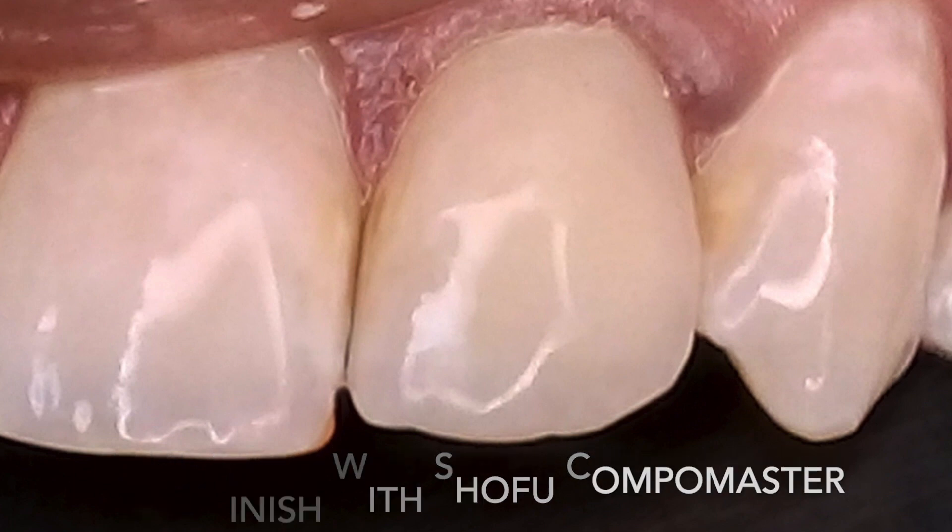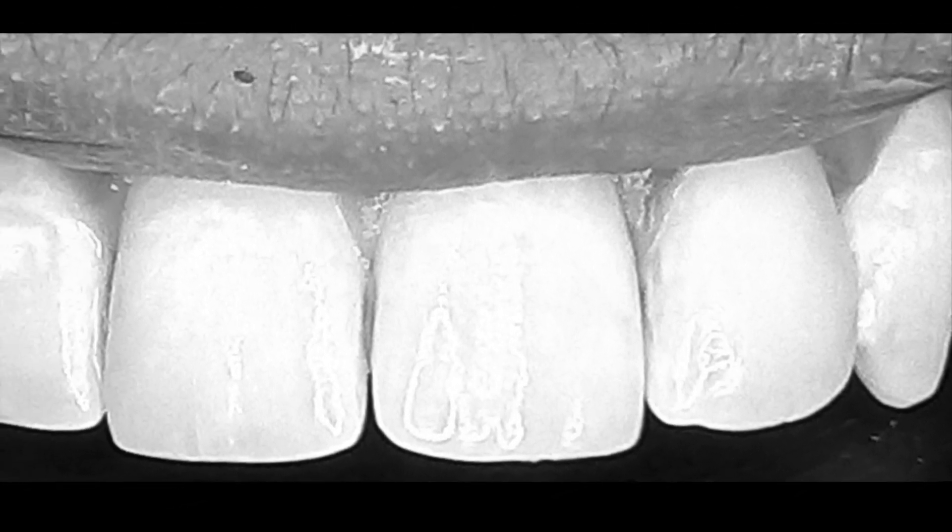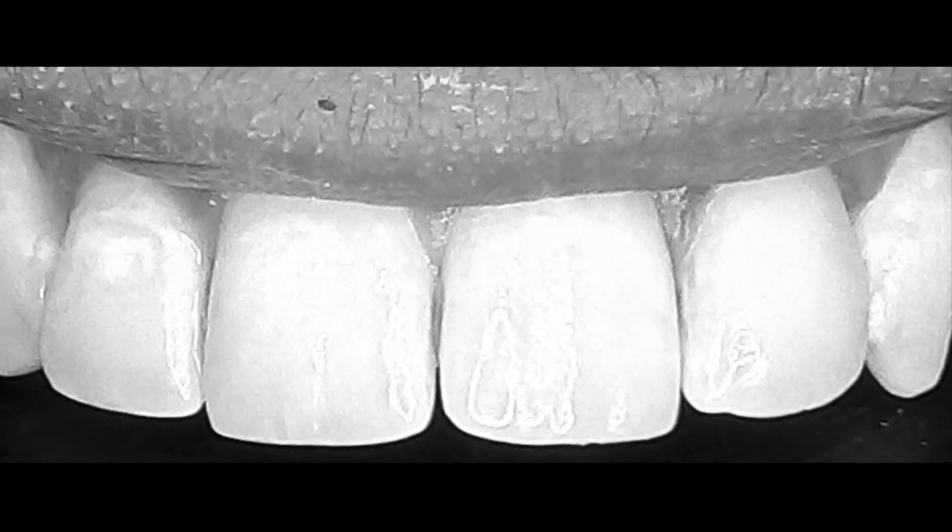Final polishing was achieved with the Shofu Combo Master. The finishing steps were done dry and the polishing steps were done wet. This black and white picture shows that it was not necessary to layer composite to achieve the desired value.